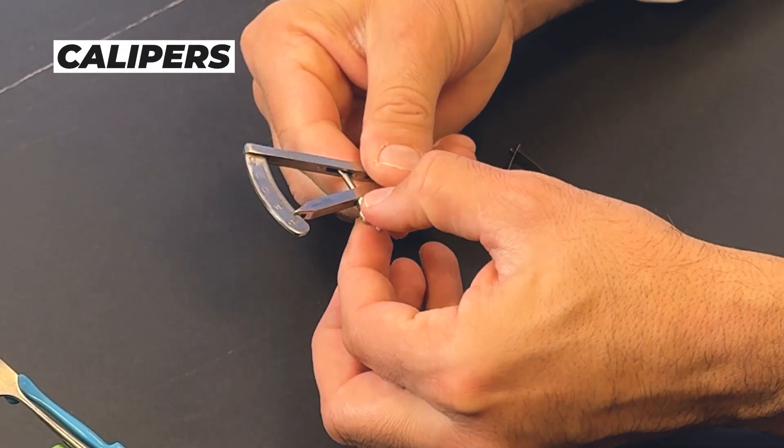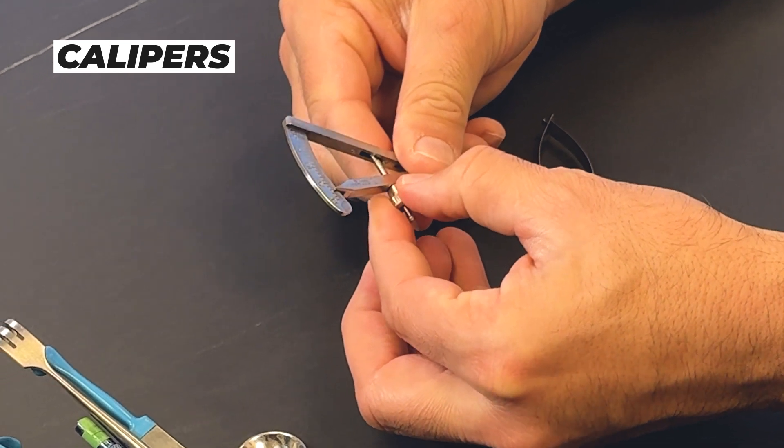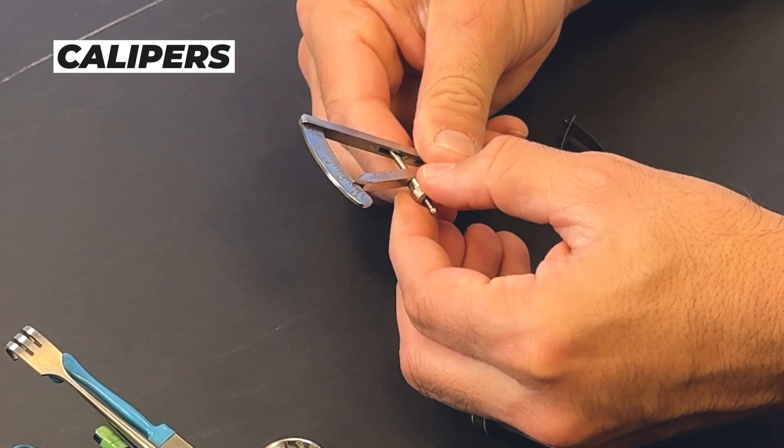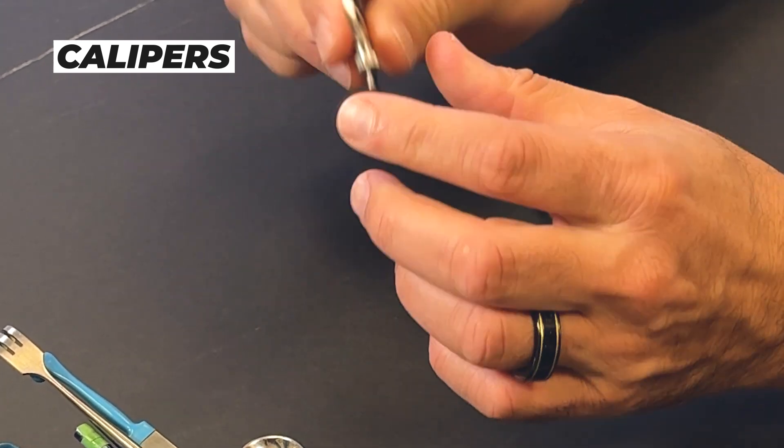When I'm doing ptosis repair, elevating the eyelid, when the eyelid's droopy, I use calipers. This is a caliper, so you can see it. Generally, if I'm resecting, let's say, four millimeters of muscle or six millimeters, I'll make my measurements using my caliper.